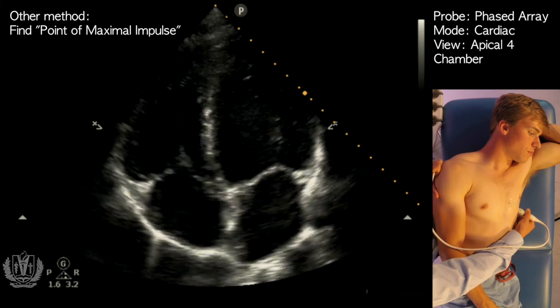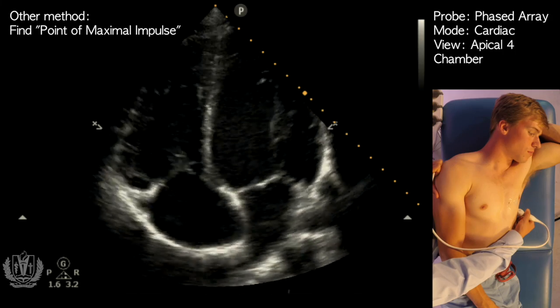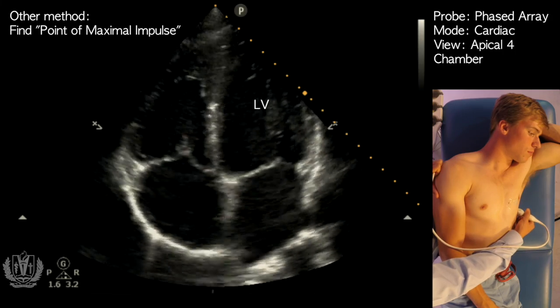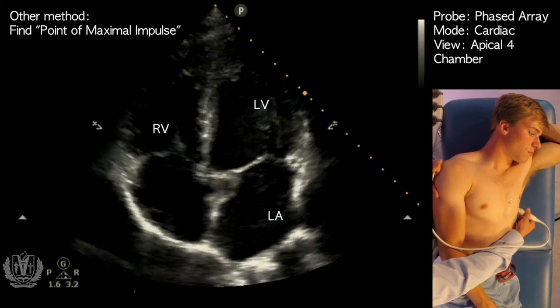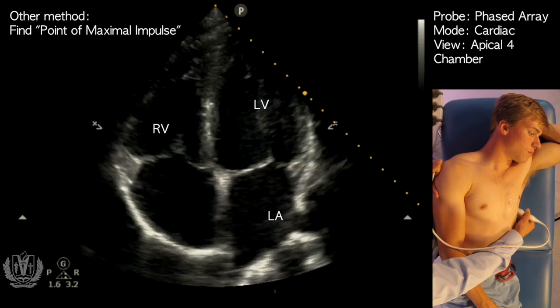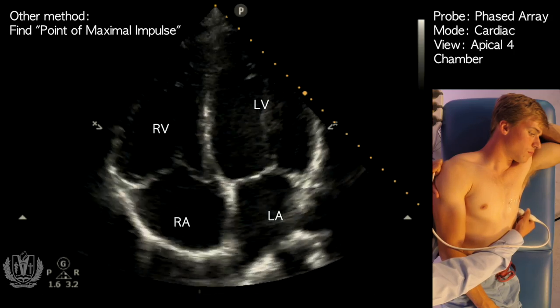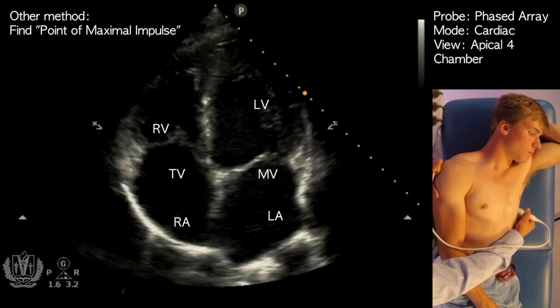Here is a view of the apical four-chamber view. You can identify the left ventricle, the right ventricle, the left atrium, the right atrium, the mitral valve, and the tricuspid valve.